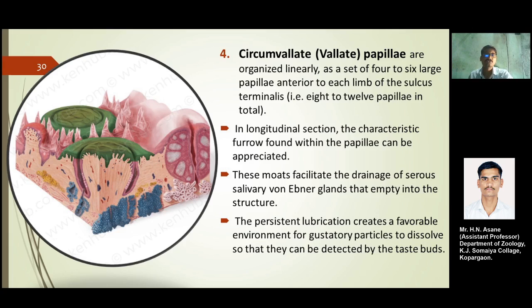In longitudinal section, the characteristic furrow found within the papillae can be appreciated. This furrow facilitates drainage, as the salivary von Ebner glands empty into these structures.